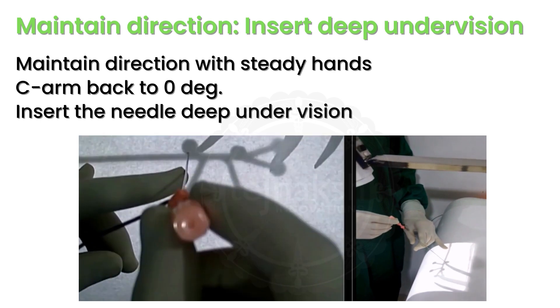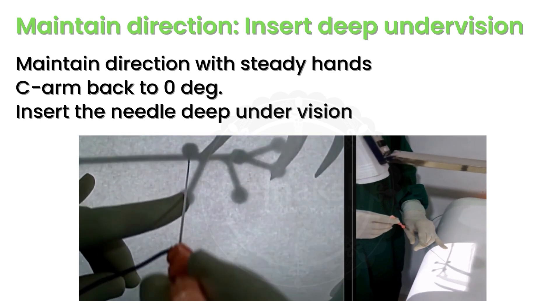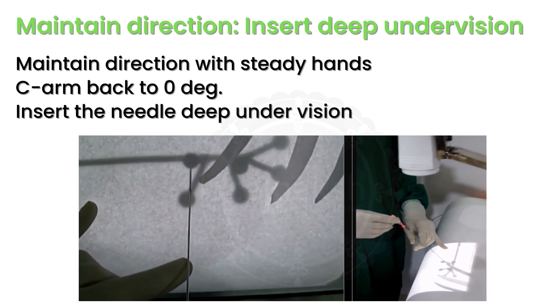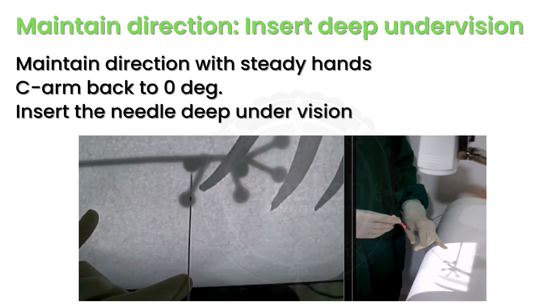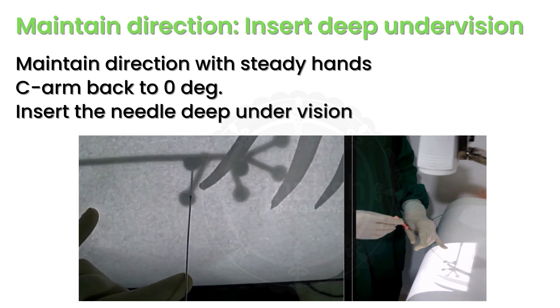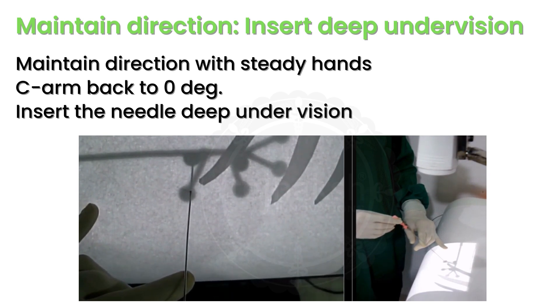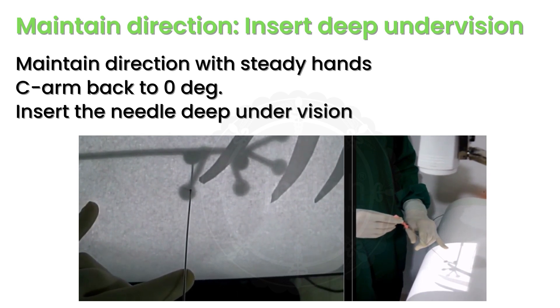In order to confirm the depth of penetration, rotate the C-arm back to zero degrees. Use zero-degree fluoroscopy to assess the depth of puncture and further insert the needle into the calyx. Confirm the puncture with free flow of urine.